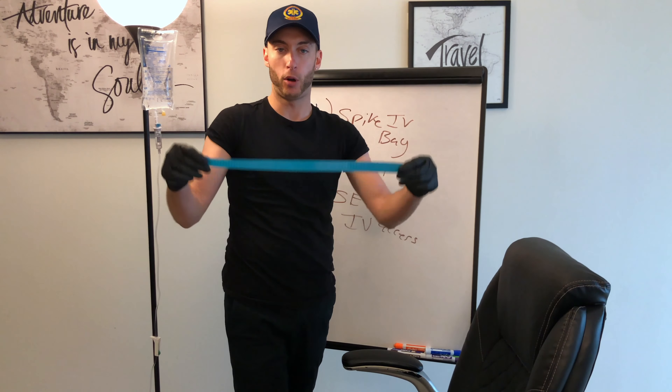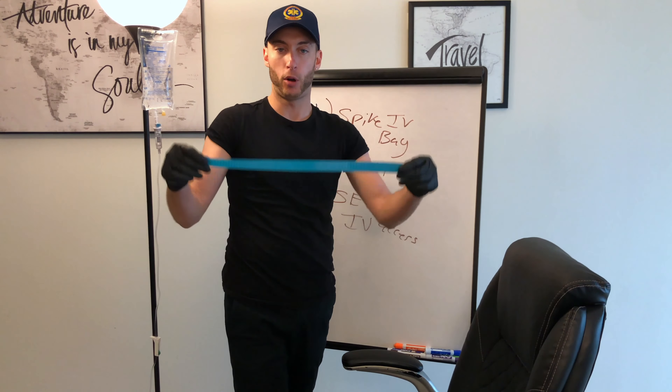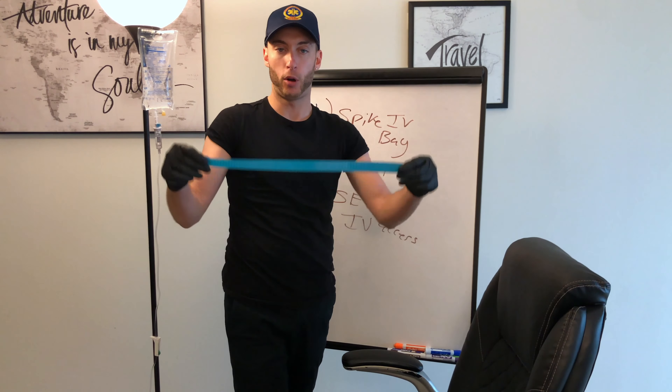Alright Fred, we're going to do a quick IV. Just going to do a quick tourniquet on your arm here, alright? Then we're going to look for a vein on you. Tourniquet is on. Now that is going to show the veins.